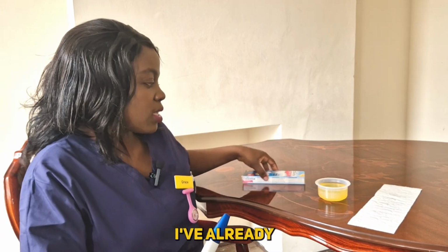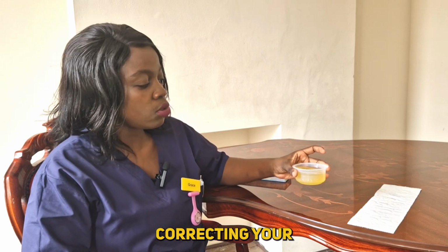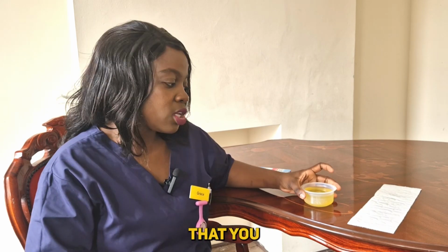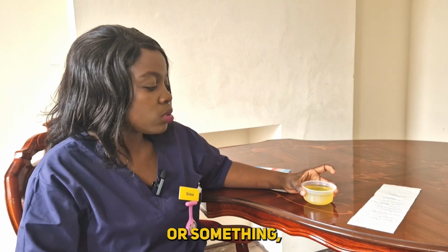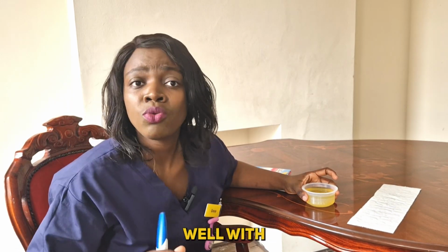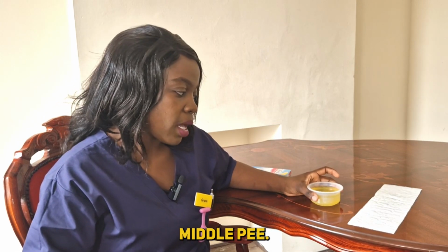Once you've read the instructions, go collect your urine and make sure that the pot you're collecting your urine in is very clean so that you don't contaminate it with various things. If you've got a bottle or something, please make sure that you wash it very well with soap and water before you go and pee. And when you pee, make sure that you collect the middle pee.